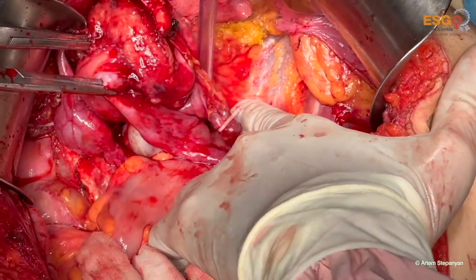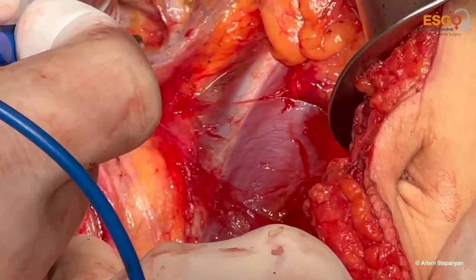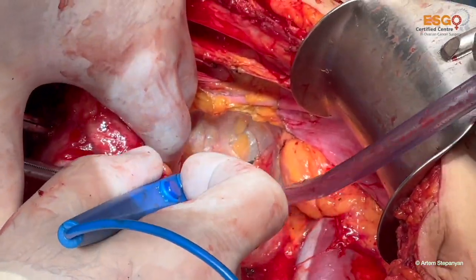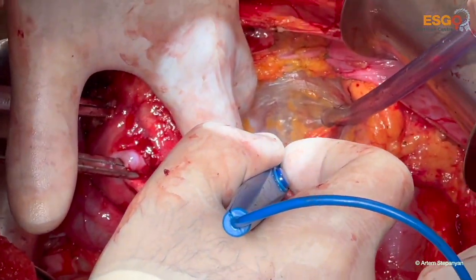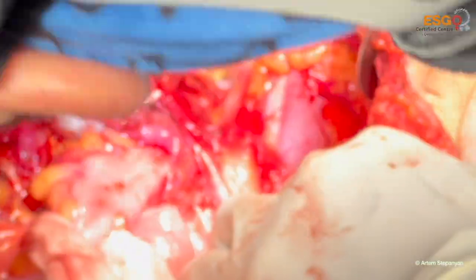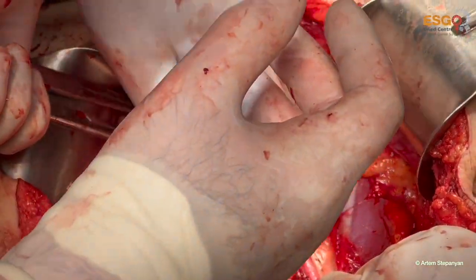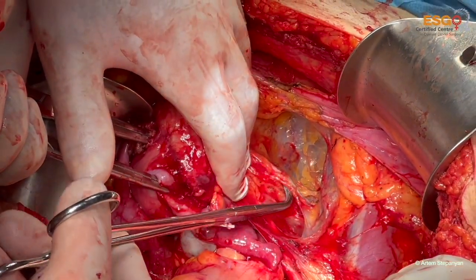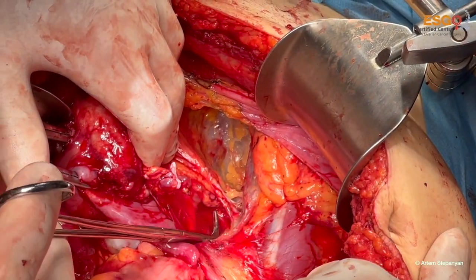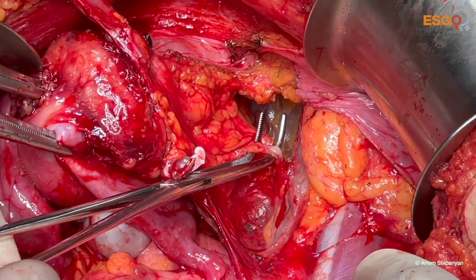Here we see the right ureter. We open a bit the pelvic vascular spaces, find the large vessels, the uterine artery, internal iliac vessels. The uterine artery will be secured and cut. This is the uterine artery, right one.